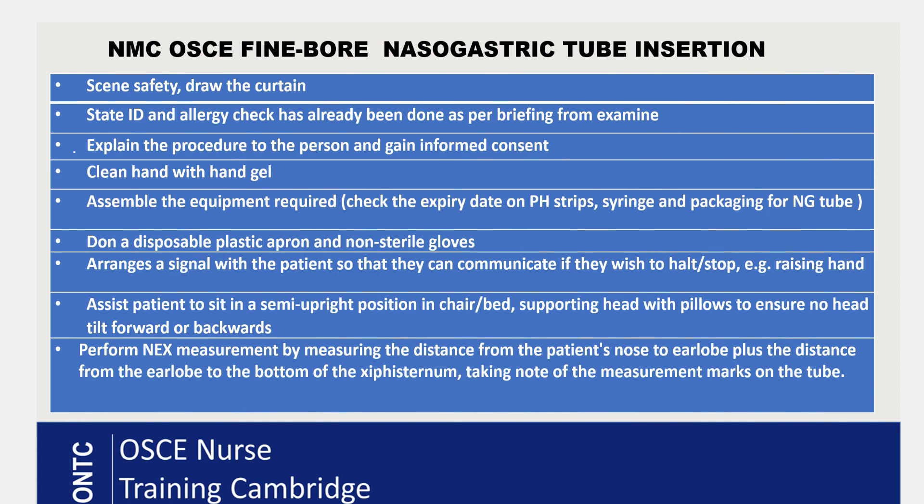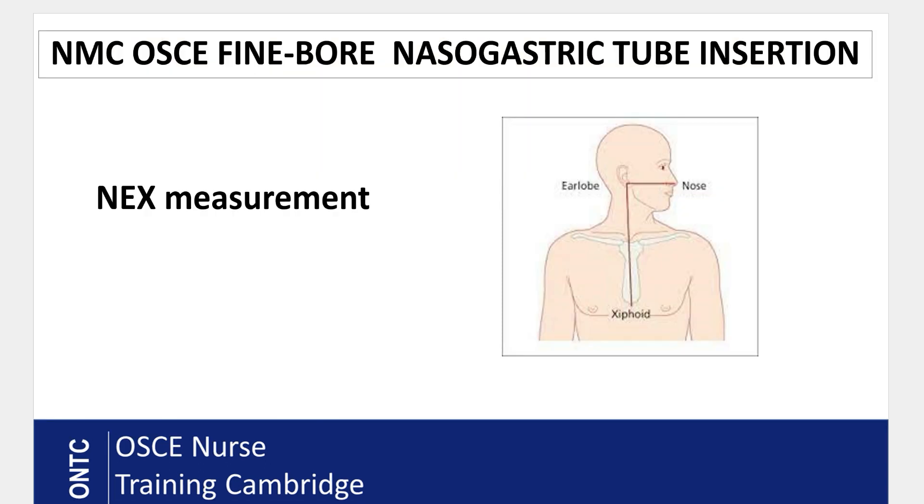Now perform the NEX measurement. N is for nose — measure from the bridge of the nose to the earlobe, then add the distance from the earlobe to the xiphisternum. Open your NG tube and measure that distance. Make a mental note of it; you don't need to document it, but do verbalize it accurately on your mannequin.